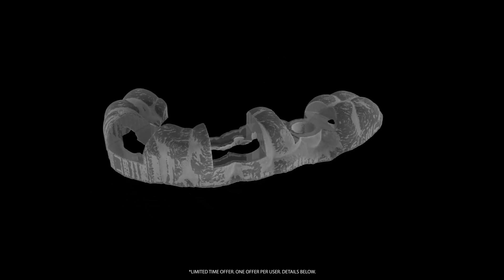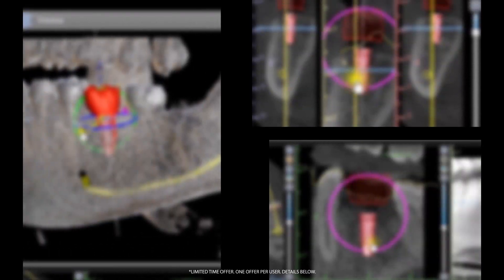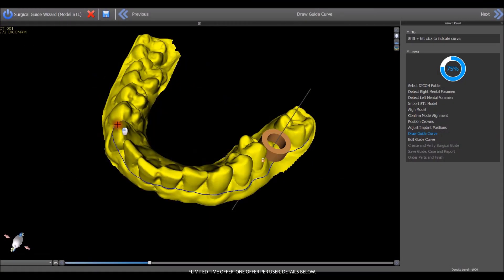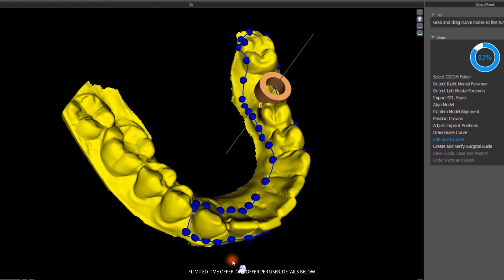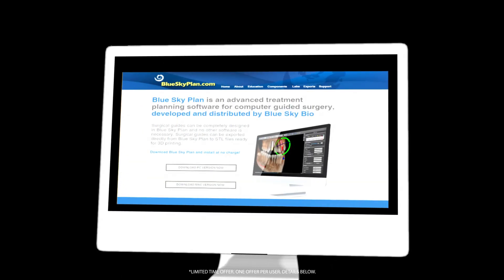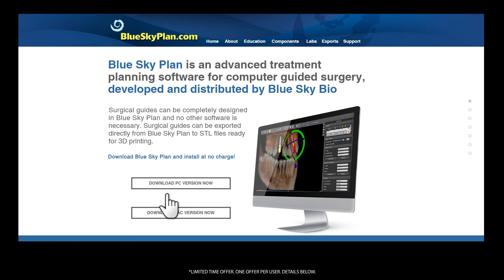Surgical guides are great, and it's easy to get started. With Blue Sky Plan, you can treatment plan and design a surgical guide in minutes for all implant systems and all guided surgical kits. Best of all, Blue Sky Plan is free and can be downloaded at no cost from blueskyplan.com.